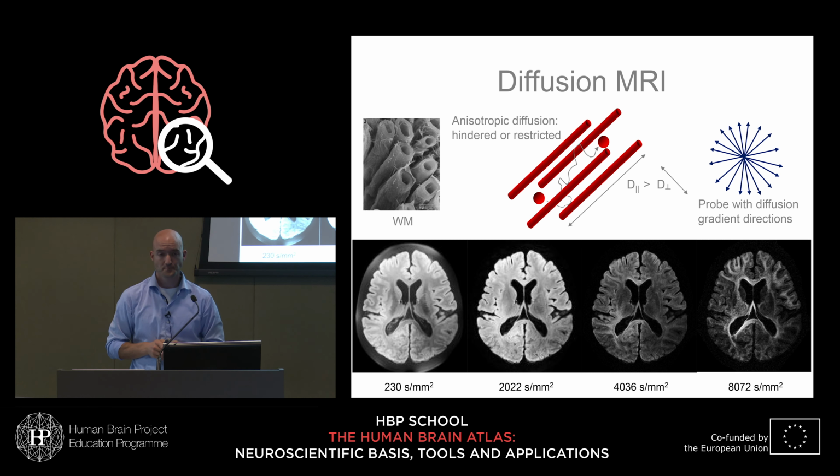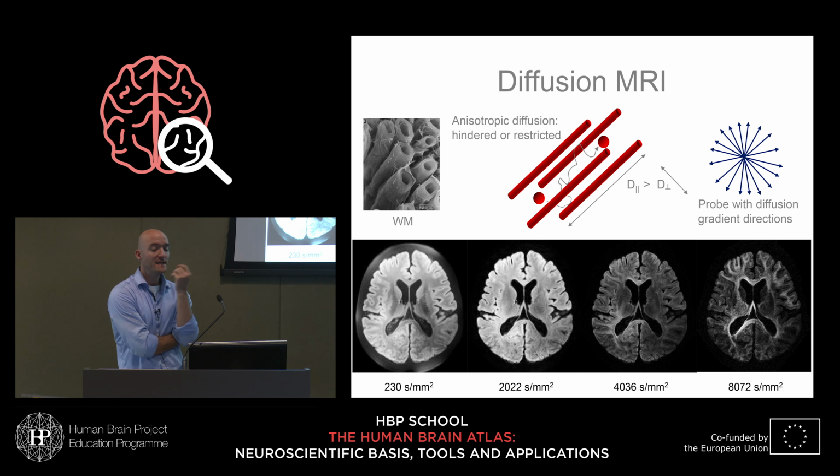Yes. How much are you restricted to very freshly fixated tissue? So could you also do that with long-term fixated? Yeah. All of what you see here has been long-term fixed, and in fact, I would argue that any whole human brain is long-term fixed because it takes months at least to fix it all the way through, right? But we've done this from brains that were fixed from about 6 months on to brains that have been fixed for 3 to 4 years.